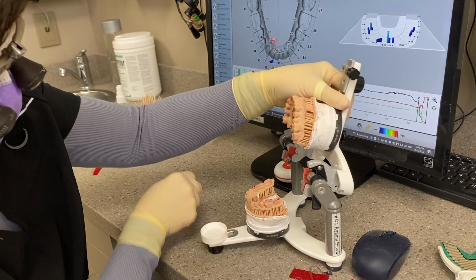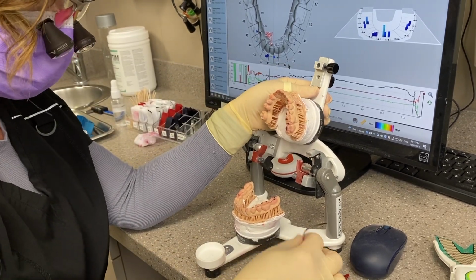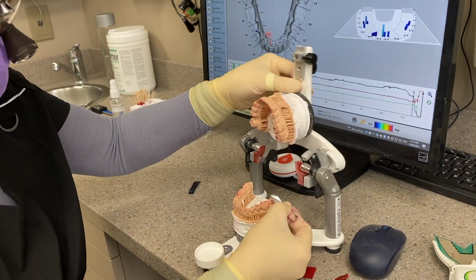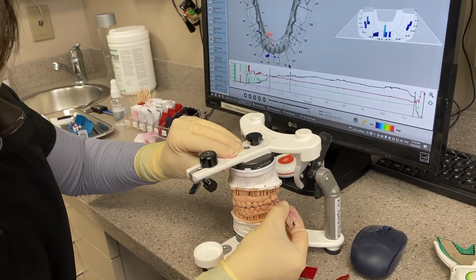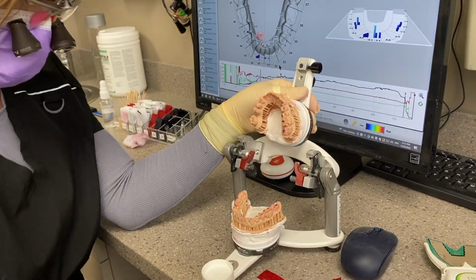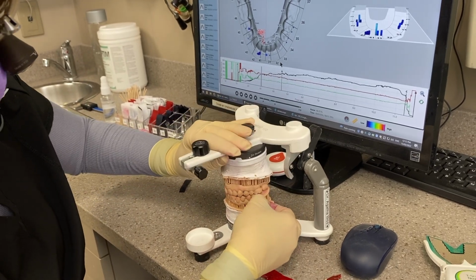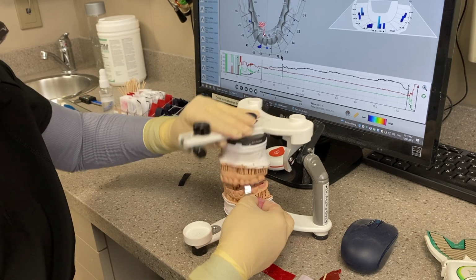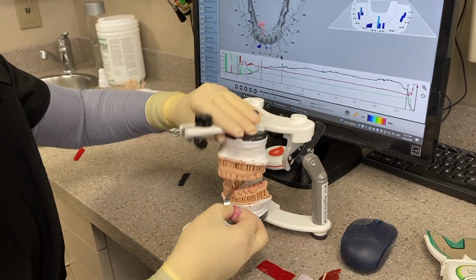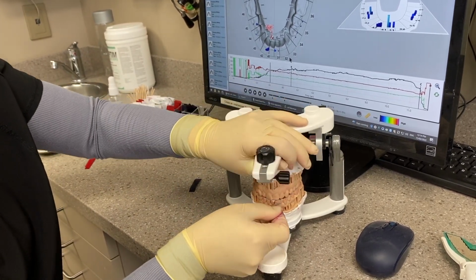Okay, so there's a tug here, and again, which contact is it, right? There's 3 that it could be. So I'm gonna test it with shim stock. I suspect it's that distal, but let's just, for fun, check all of them. So you're gonna go distal buccal, comes right through. Mesial buccal, comes right through. Okay, let's see. Good contact there, good contact there, good contact there. Good contact there. Okay, so let's make sure the front teeth are not touching.